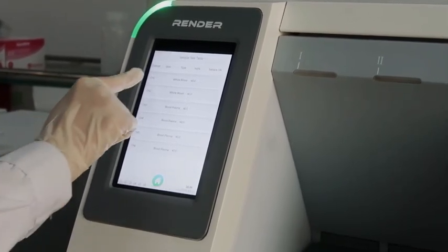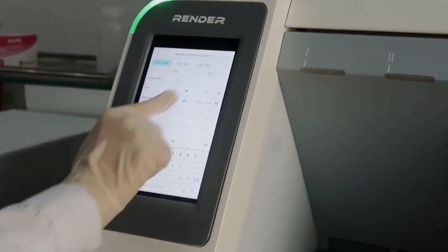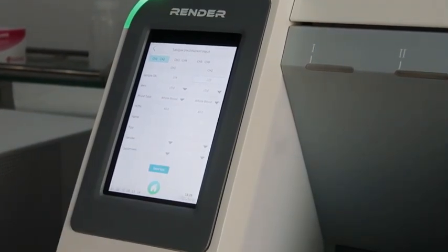Tap the testing interface and type in the sample serial number in the channel where the corresponding reagent cartridge is placed.